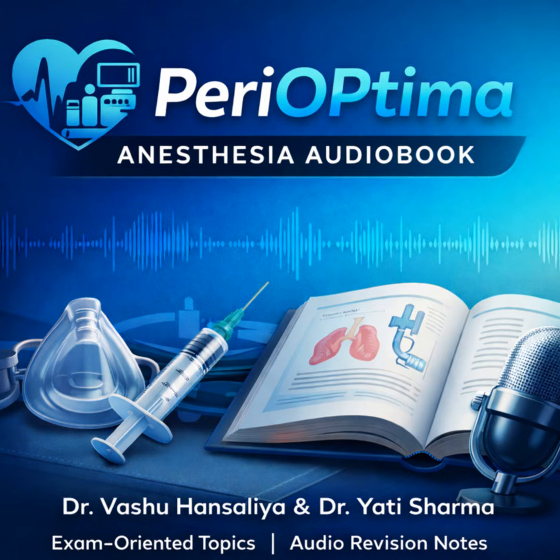It's just fascinating to me how far back this commitment to safety actually goes. It really grounds the whole discussion when you think about the history. Oh, absolutely. You must always start by acknowledging the foundational work. People like Sir Frederick Hewitt. Over a century ago, right? It was. He recognized the inherent danger of just combining N2O and air. He realized it created an unacceptable hypoxic mixture.